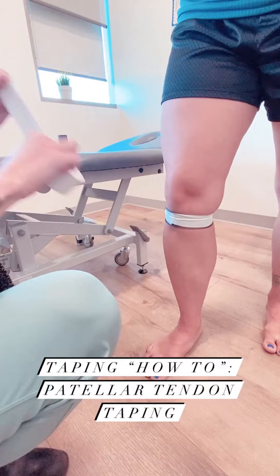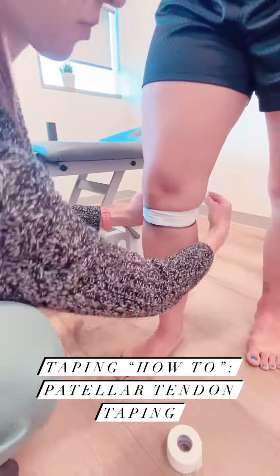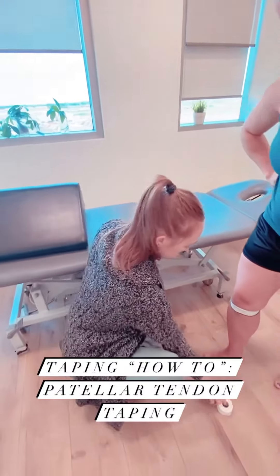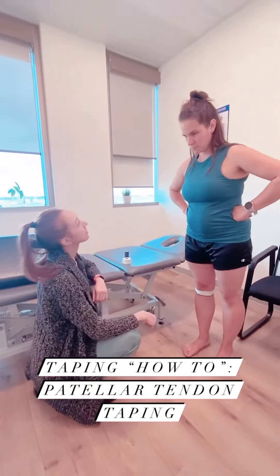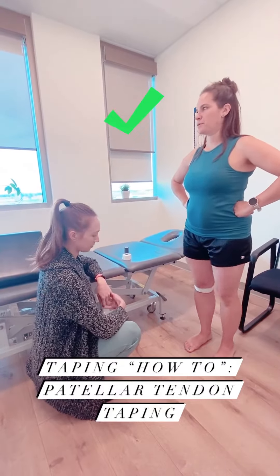For the last strip, we always want to make sure we're not cutting off the athlete's circulation. Toes looking okay — how are you feeling? Good. I'm not cutting off your circulation in your foot? No. Perfect.